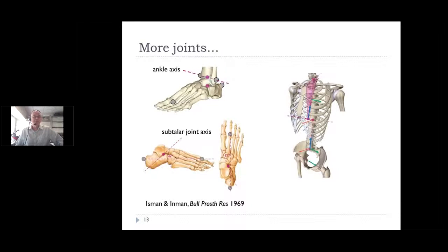And a few examples of that. For the ankle, we put the ankle joint center right in between the two markers, and the axis goes through the markers as well. Then we drop down a certain distance, and we get the center of the subtalar joint, and in the subtalar joint we draw a line that's 42 degrees inclined from a line through these two markers.